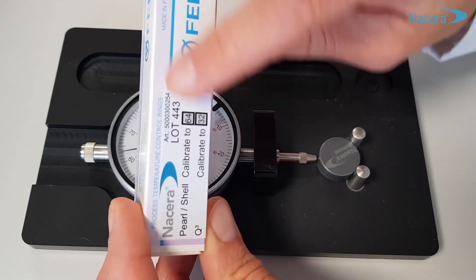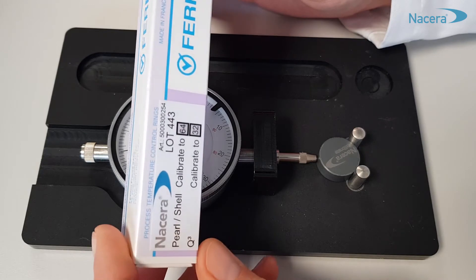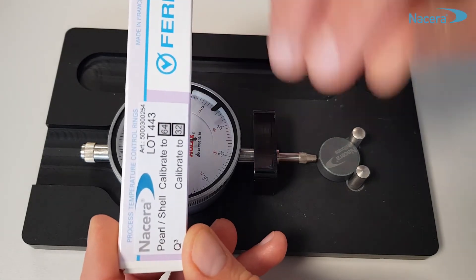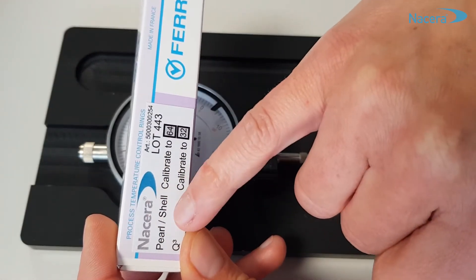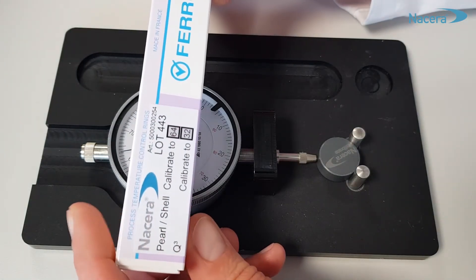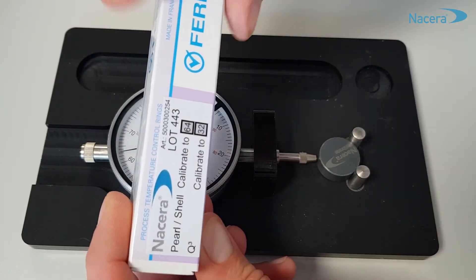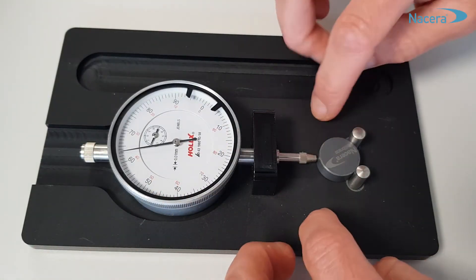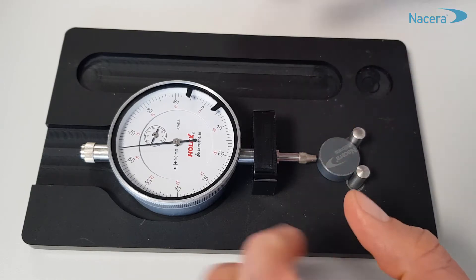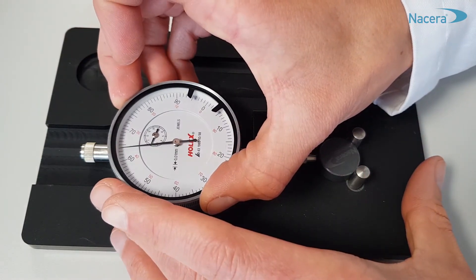There are different types of lots available. Here for example, we sintered 3YTZP Pearl material at 1500 degrees Celsius. With Pearl, we have to calibrate to 64. With the gray body still positioned, turn the dial gauge until it indicates 64.